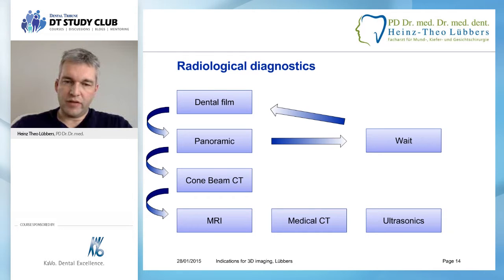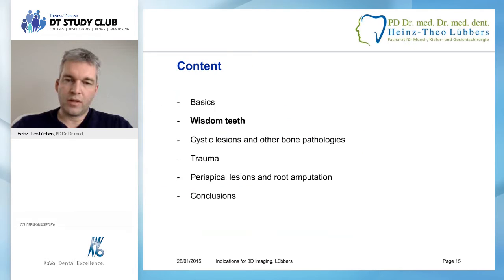And at every point of this chart, you can turn around and say, well, time is also an option. We can look at this fourth dimension and look again later, depending on the patient situation, of course, depending on his clinical problems. But in very many cases, with typical radiological signs but no clinical signs, this is a useful option, I would say.